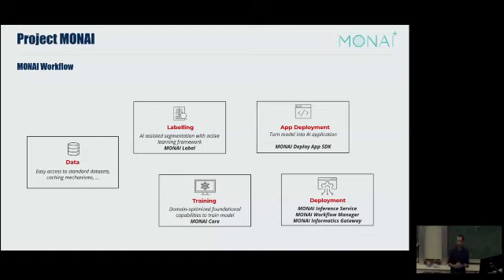You can plug them in the way you want, plug in the loss you want, the regularization you want. And then once you've trained your model, you can package your tool into an application. And then, up to the bottom right, it gives you the capability to deploy it within a clinical environment with a lot of orchestration with the different systems from the hospital. So basically we are trying to cover the full spectrum of use, starting from the data on the left-hand side up to deploying it into a clinical environment.